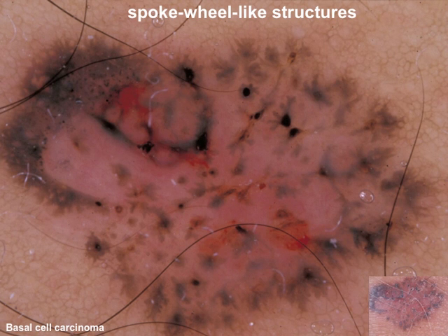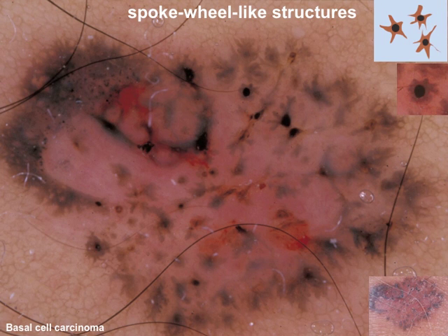Here you have a pigmented basal cell carcinoma in a skin type 4 patient. You see these spoke-wheel-like structures throughout the entire lesion, some degree of ulceration, with the dark central hub and the radial brownish projections towards the periphery. Another case, courtesy of Dr. Rabinovitz — again, you have these dark hubs and the radial brown projections towards the periphery, spoke-wheel-like areas.